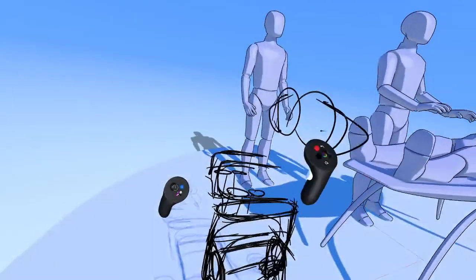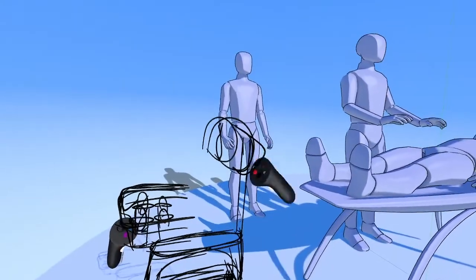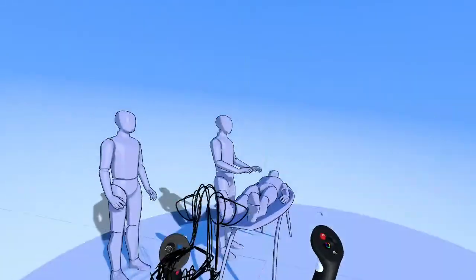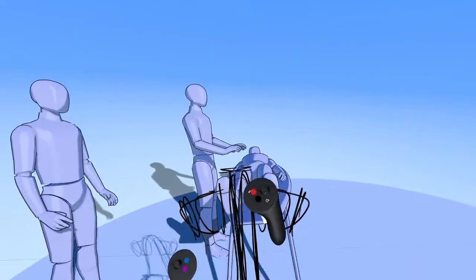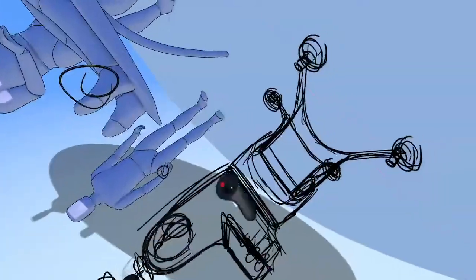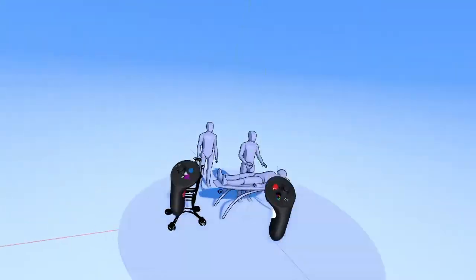Oh, that's kind of cool. Okay, so we can split the shelf and put it here so that the tools are here, and then the shoulders are up here, like that. It's not the prettiest thing right now, so it's all right, we'll focus on that in a little bit. And then this probably needs some vision, so yeah, we can put sensors here, up top here, and also sensors in the arms as well, some cameras and sensors there. So generally this is something we could work with. It's not a terrible shape. Let's see what you guys have dropped in the comments and work with that.